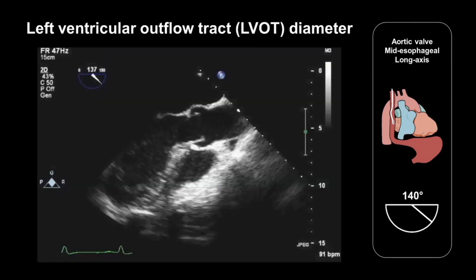We should also take some measurements in the long axis view. One of these is the diameter of the left ventricular outflow tract. This measurement is normally taken within half a centimetre of the aortic valve annulus. This measurement is used as part of a continuity equation when calculating the effective orifice area of the aortic valve, particularly useful in cases of aortic stenosis.